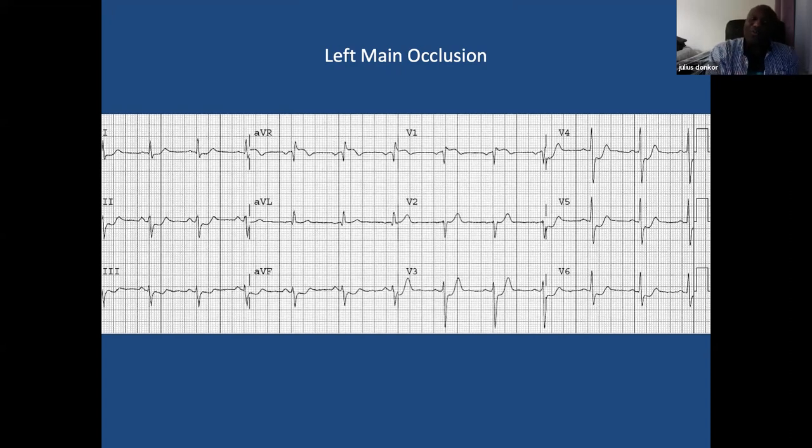So you can also get exactly this particular pattern on your ECG with triple vessel disease as well. So there's extensive disease in your coronary arteries. Is that a left main or triple vessel disease? You can get either with this one. Widespread ST depression, and you're looking at V1, usually ST elevation, and aVR as well, ST elevation. It's just remembering what it looks like. That's patterns.